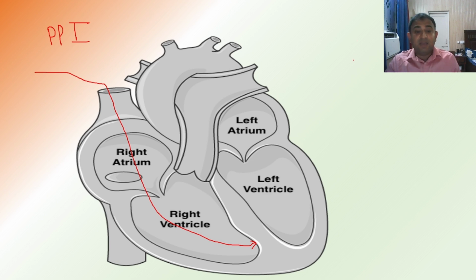And how does a heart function? First, there is diastolic filling of the left ventricle, then there is the atrial kick, and then finally the ventricle contracts, and then it relaxes. In the case of a single lead pacemaker, there will be a dyssynchrony between the atrial kick and the ventricular contraction.